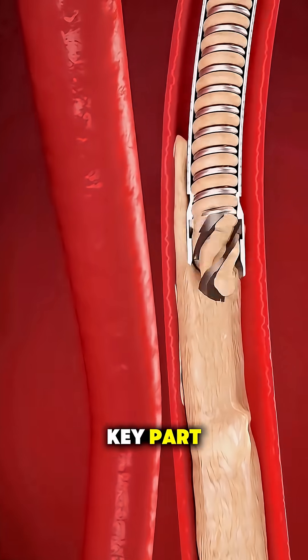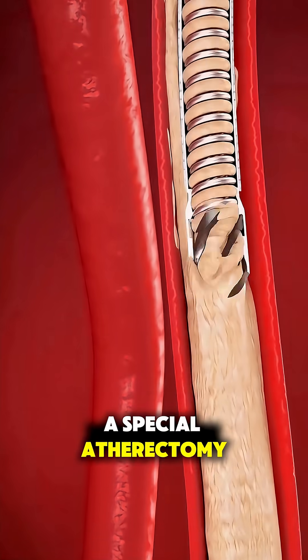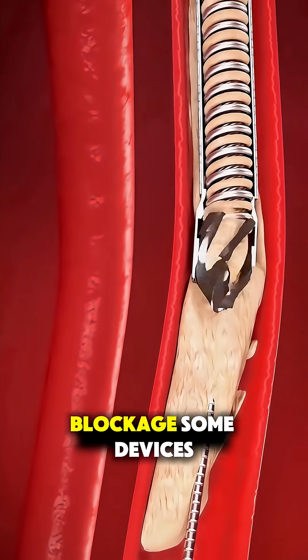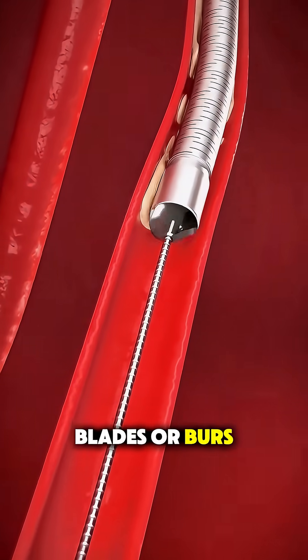Now comes the key part. A special atherectomy device is advanced through the catheter right to the blockage. Some devices have tiny rotating blades or burrs.